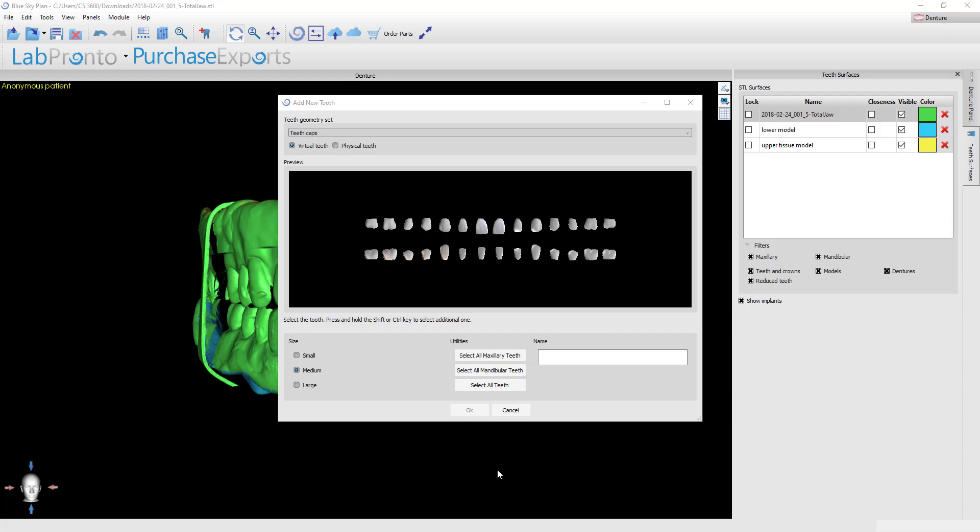In this video I'll show how to set digital denture teeth in the Blue Sky Plan denture module. In the last video I showed how you import all your models and get them in the correct position.